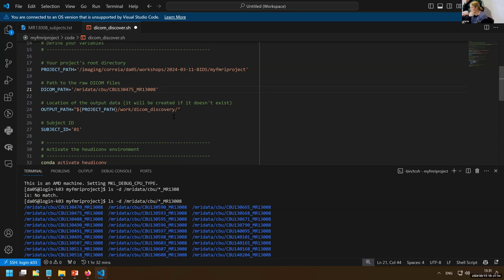Well, if the aborted sequences are EPI sequences, then it's not difficult. Maybe it will be obvious later. So what could be different? If they didn't have a field map, for example. Yeah, they might be missing something.